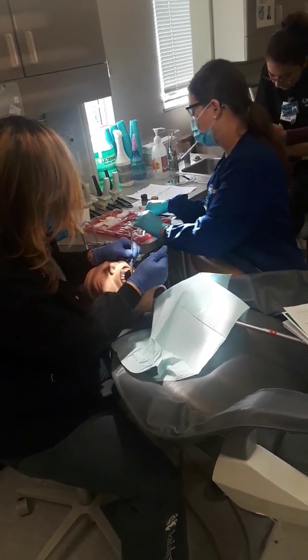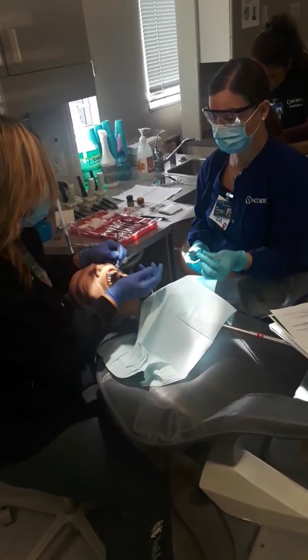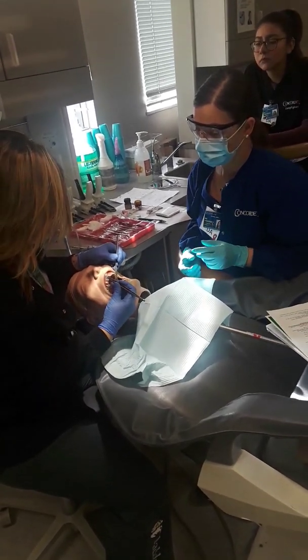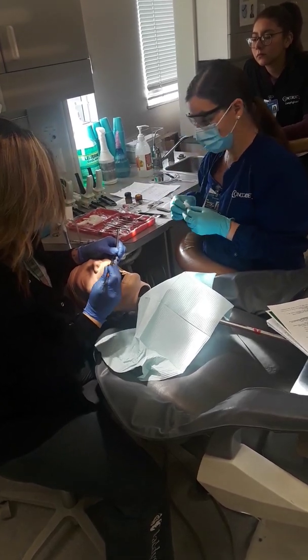Okay, so the cord is packed. Wait 5 minutes is the time, as she passes me the cotton pliers to remove the cord from the sulcus. So 5 minutes passed.